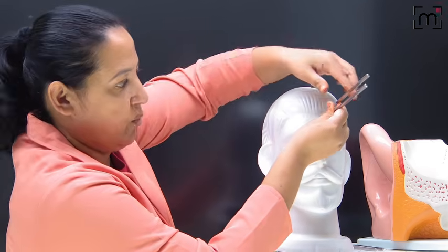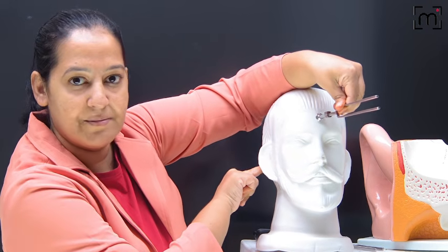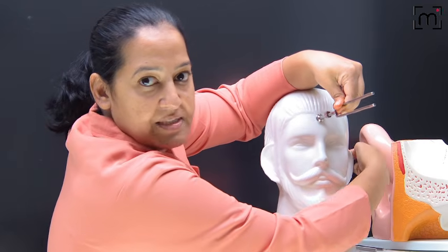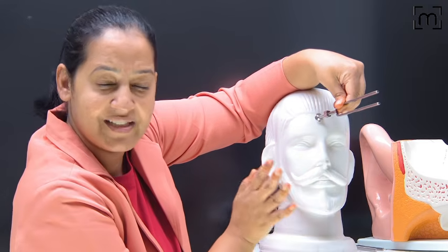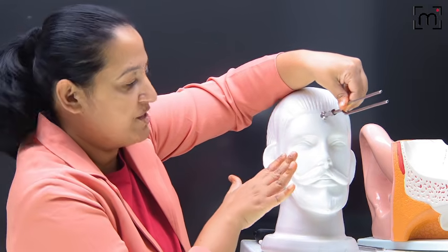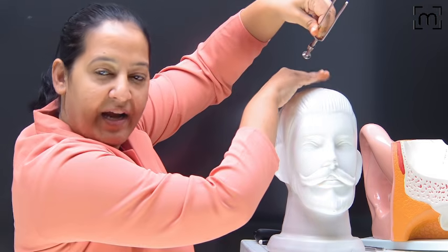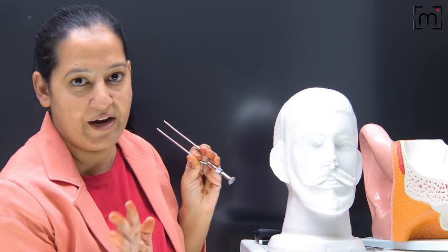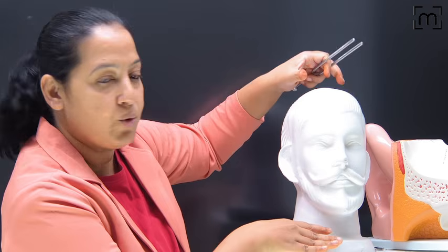You are getting it? So what I am doing here, I am activating my tuning fork and keeping it at the vertex of the patient like this. Sound waves will go here and activate this mastoid. The same vibrations go from here and activate this mastoid. So both mastoids are activated simultaneously with the same intensity if the patient is normal. If the patient doesn't have any deafness, sound waves go to both sides of the brain and are interpreted the same, so there is no lateralization. The patient says that I can hear sound on both sides equally. There is no lateralization, it is normal. If the patient doesn't have any deafness, it's normal.